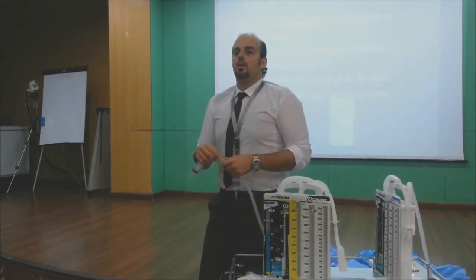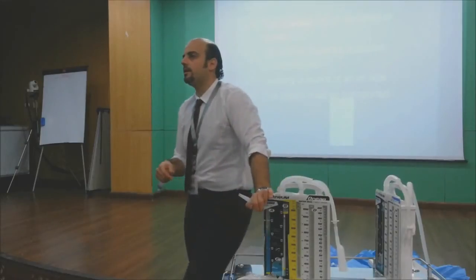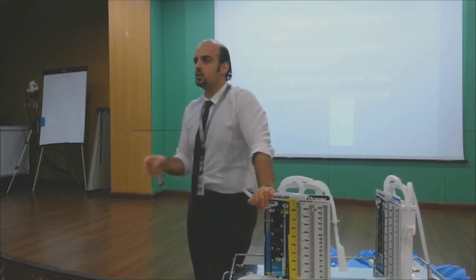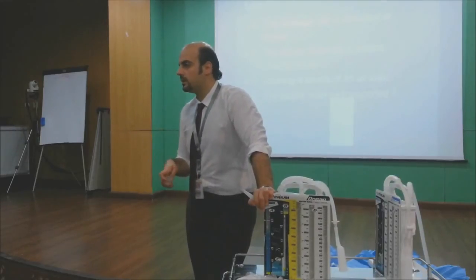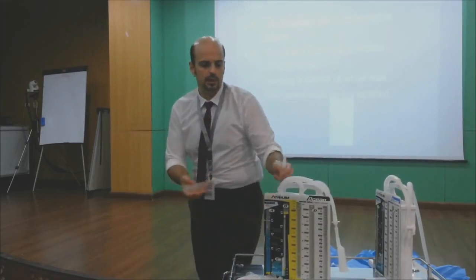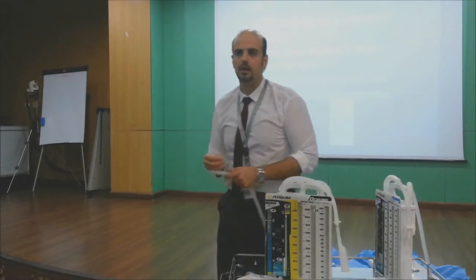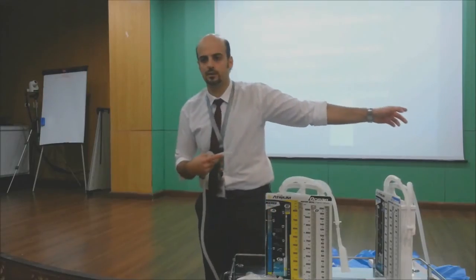Okay. What is the right negative suction that I can apply? I cannot apply it here now because we don't have negative suction. Is it bubbling like this, or just to see a bubble? Just to see a bubble, okay? It's not right to just do it, because it will suck all the water into the suction, okay? After a day of suction, you will find all this water in your wall suction.